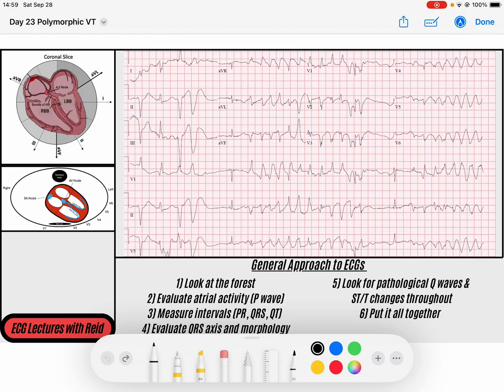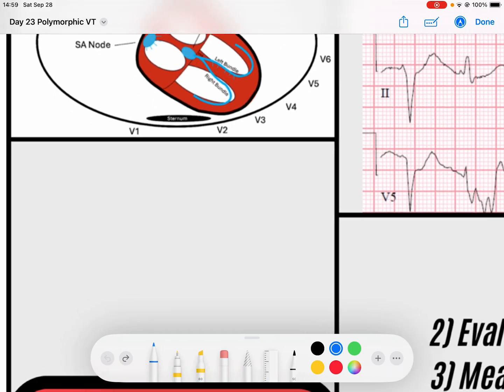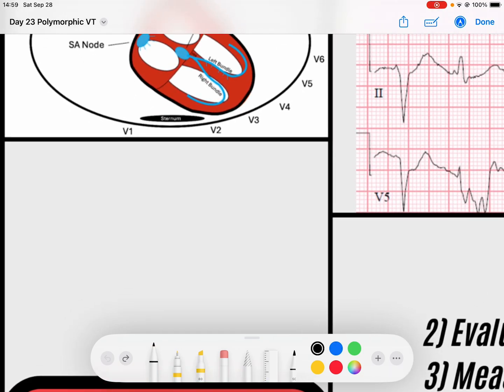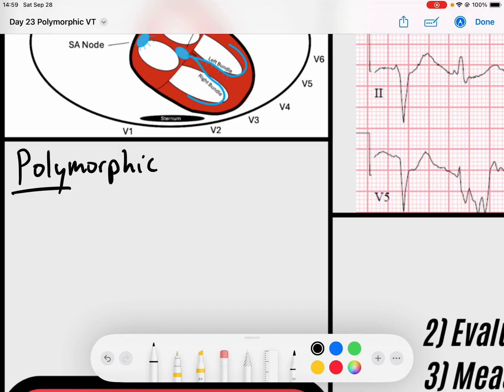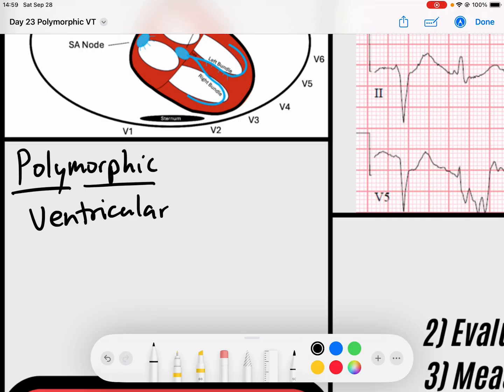So the first thing I want to do is just break down the word itself — polymorphic ventricular tachycardia. Polymorphic stands for 'poly,' which is multiple, and 'morphic,' which is morphology or shape. So multiple shapes. This is a ventricular tachycardia — a tachycardia of ventricular origin — that has multiple shapes, meaning that every single QRS complex is different.